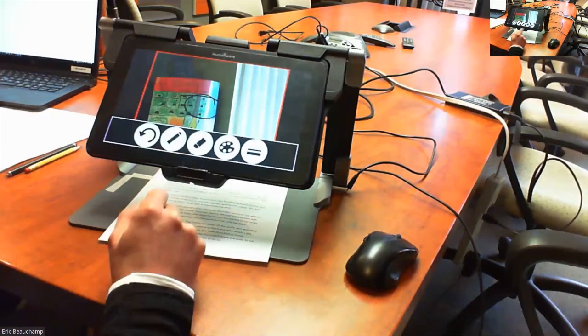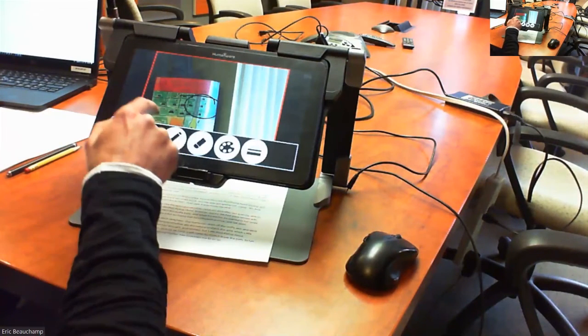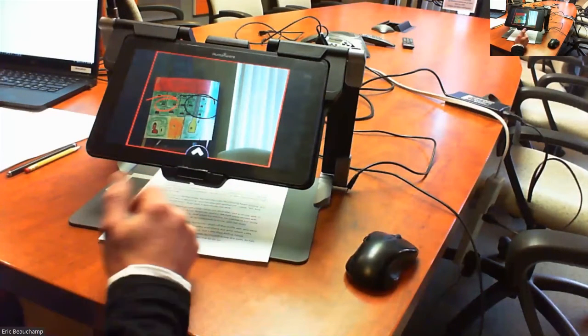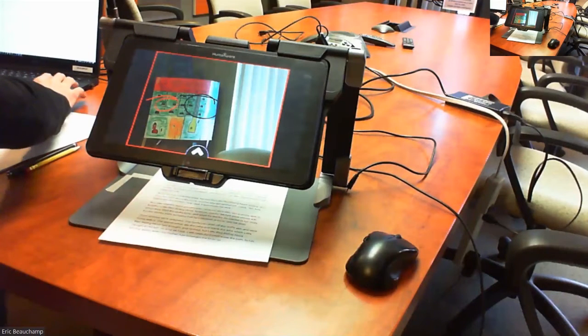In that annotation application, you can change the colors if I want. Let's say I want red. I can choose red. And again, the highlighter, I can use also a keyboard on here, which is, again, another feature we'll cover in another webinar.